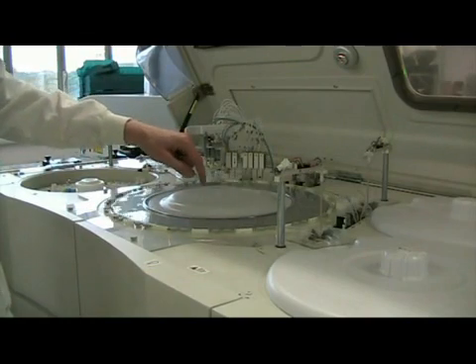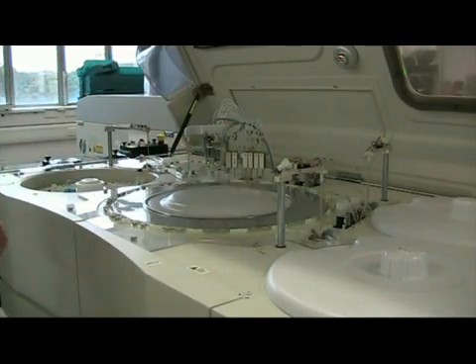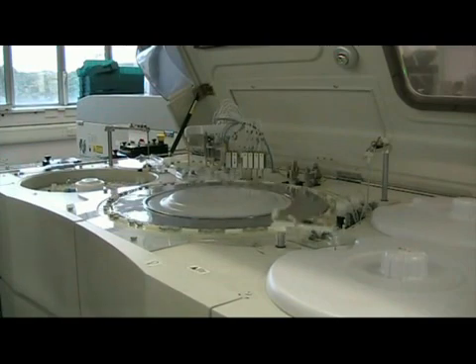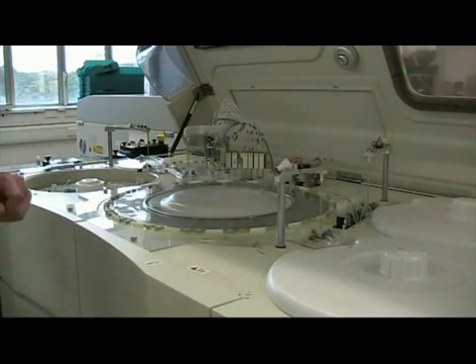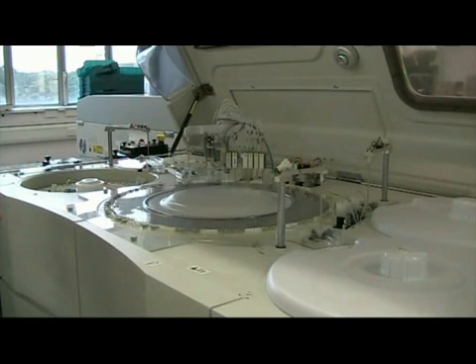These readings are used to produce the result for the individual assay. For example, if it was a glucose assay, we would produce a calibration curve using calibrators with known values, and then see what the absorbance reading was at the end of the 10 minutes for the patient sample, and put it back into the calibration curve to produce a result in millimoles per liter.